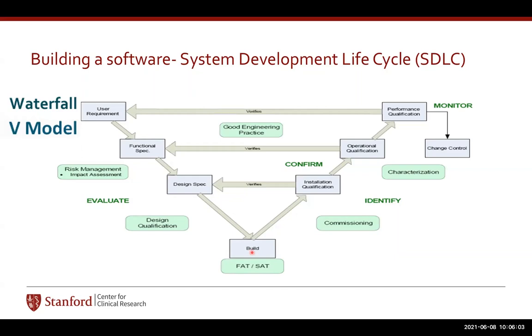when you are delivering a big, let us say, cancer treatment system, then the site has to be qualified for that. For example, one of the radiation devices may take two football fields' worth of space to be installed. I'm mentioning this so that you can understand the complexity of some of the devices. Then you do the installation qualification. There are things which I will describe in a little more detail. Then the OQ, and then finally, the performance qualification.